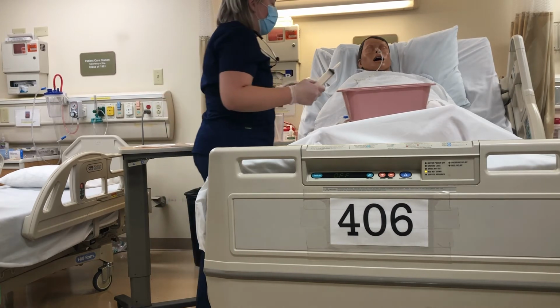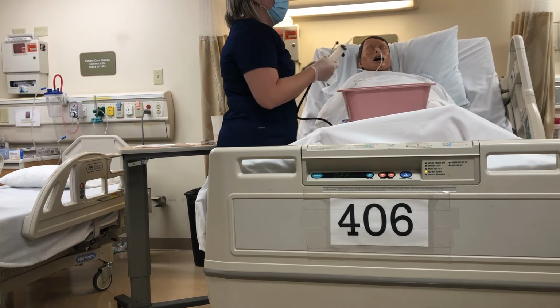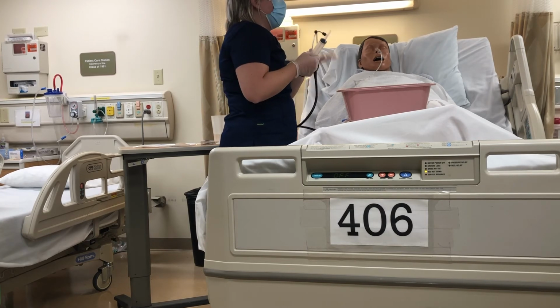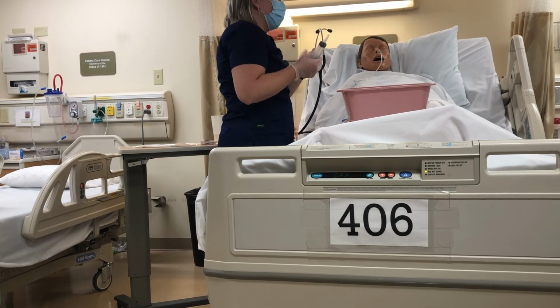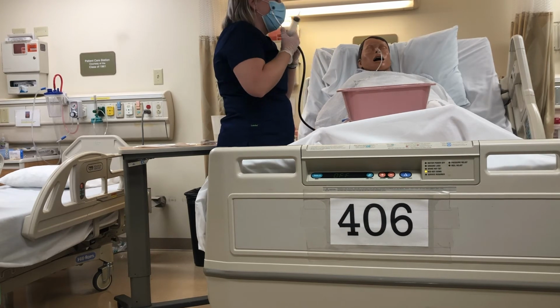And while we're waiting for that, I'm going to put a little puff of air in your tube, and I'm going to listen to your left upper quadrant, and if I can hear that puff go through, that's going to indicate that it is in placement. Now that's not the only verification method that we'll use. You'll also get a chest x-ray, but all these measures are just going to help ensure that we did in fact place it in your stomach.